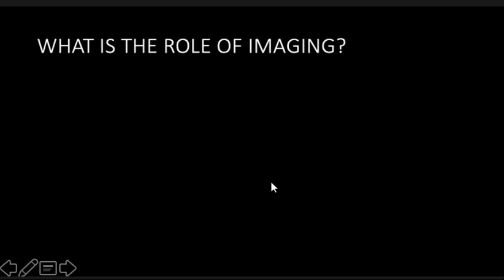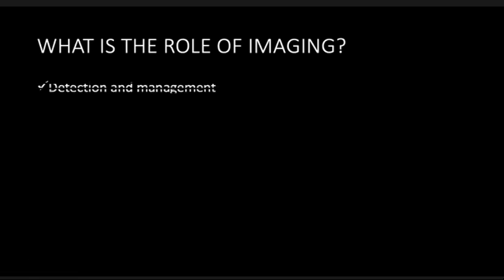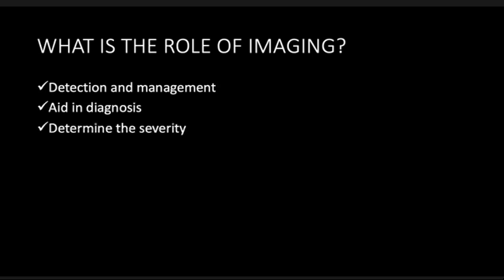The standard test for diagnosis of COVID-19 is RT-PCR. So imaging tests play an important role in detection and management of these patients, and have been used to help diagnose the disease, determine the severity, and guide and assess treatment response. Current recommendation of the vast majority of radiologic associations is that imaging tests should not be used as screening tools for detecting COVID-19. Rather, they should be reserved for evaluating complications.